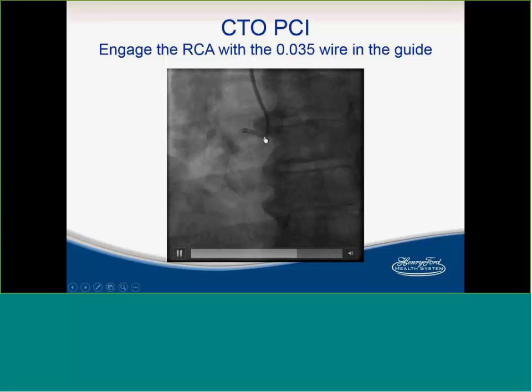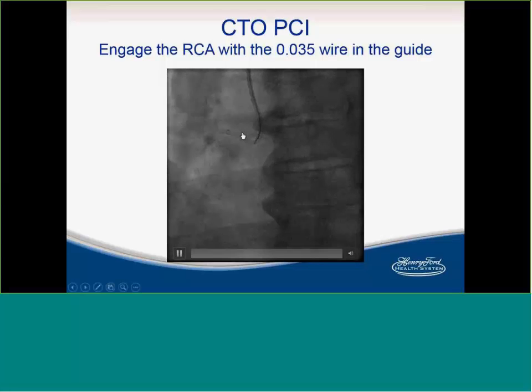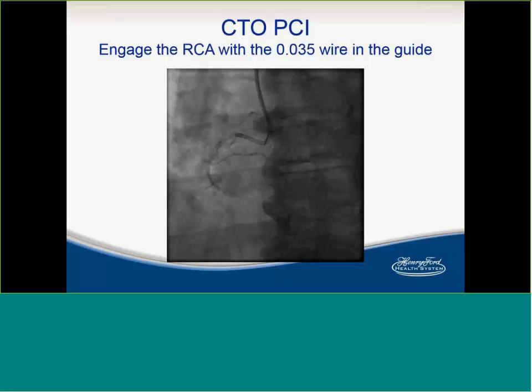A lot of times when you're coming from the radial artery access and you're trying to engage the RCA, it's really difficult to manipulate the guide, especially if you're going to put an AL1 or AL 0.75 and it keeps slipping up. So what I do, I just go with the back of the J-wire very carefully and never through a kink, and I kind of straighten the guide and engage it and then I pull it out. But I never exit the guide with the back of the J-wire. It's going to help you control your wire better from the radial artery access. Helps you control your guide.